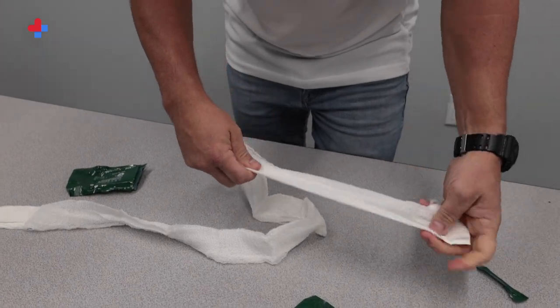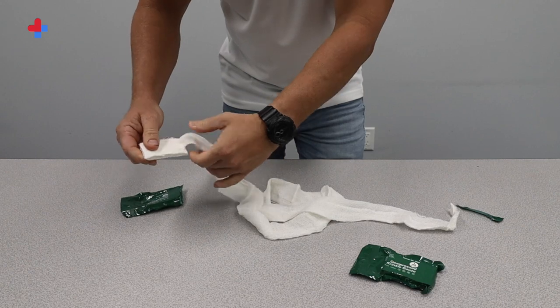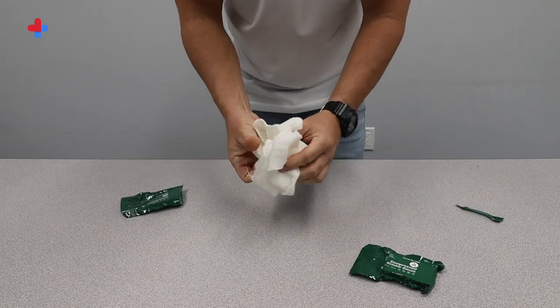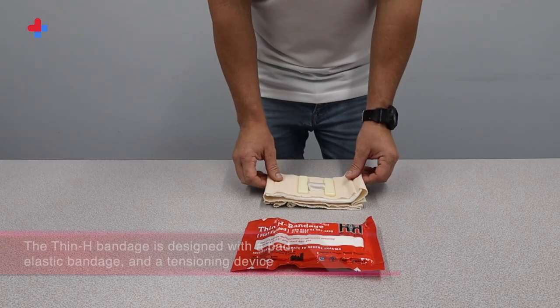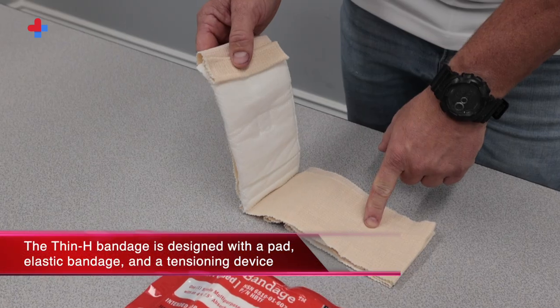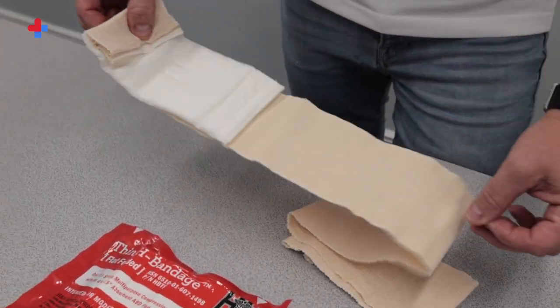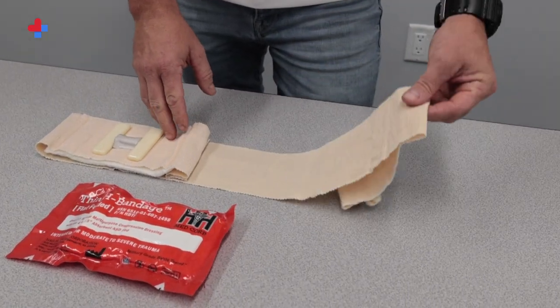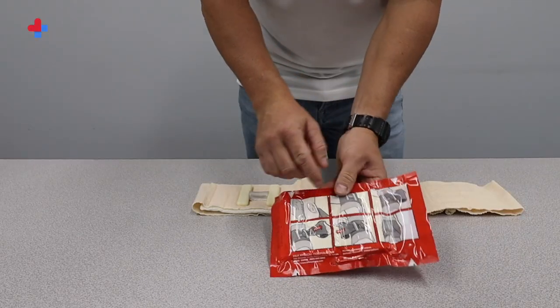For application, pack the inside of the wound with as much gauze as possible and apply direct pressure. You can use the remaining portion of the gauze, the second crinkle gauze, or the thin H bandage to secure the wound dressing. The thin H bandage is designed with a pad, elastic bandage, and tensioning device — the H. By wrapping the elastic wrap around a wound and then pulling down on the H, you provide direct pressure over the wound area. This increases pressure over the wound and stops bleeding faster.